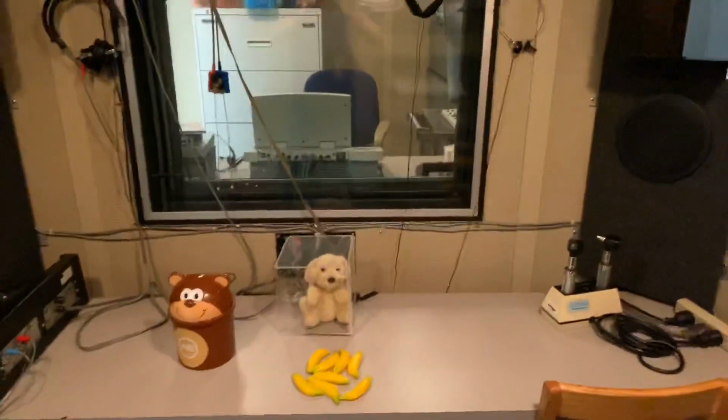At any rate, the next thing we're going to talk about, I didn't finish this. With sound field testing, even if a baby has normal hearing in his left ear and is deaf in the right ear, the baby still can turn his or her head to the sound. They can localize it pretty well. And you can't really make a statement about which ear it is that might have hearing loss. So when we do VRA testing, and I tell a parent, well, I know your child is hearing well in one ear. This is this infant who's 11 months old, I know is hearing well in one ear. And they will say, well, which ear? And I'll say, I don't know.